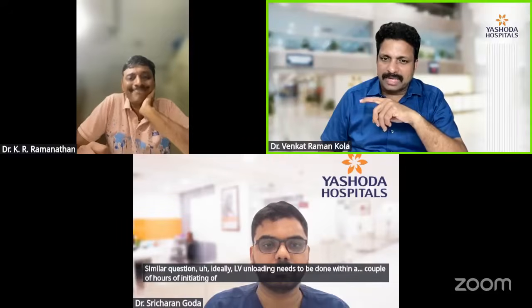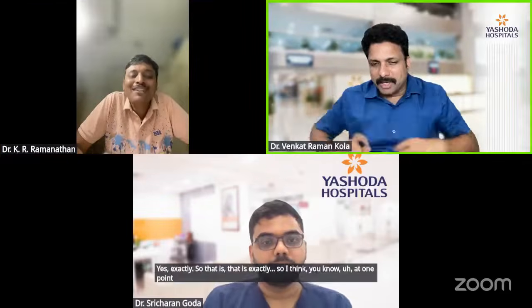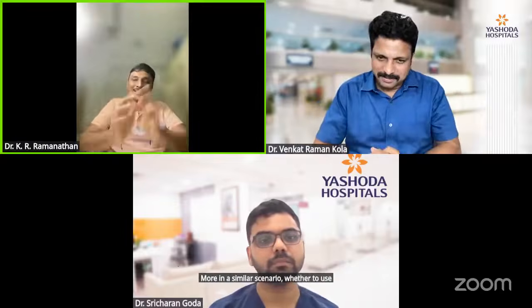Similar question. Ideally, LV unloading needs to be done within a couple of hours of initiating VA ECMO, rather than a reactive unloading. Or sometimes the same question, prophylactic versus a rescue unloading. Yes, exactly. So I think at one point the questions were the same: ECMO in a similar scenario, whether to use ECMO in a rescue scenario.